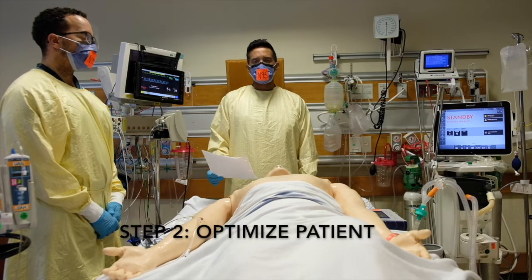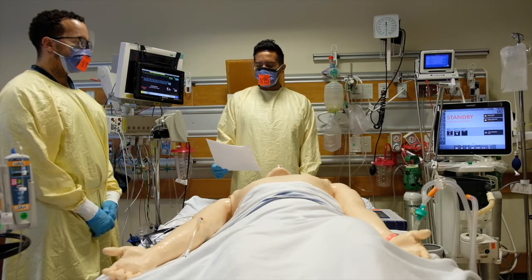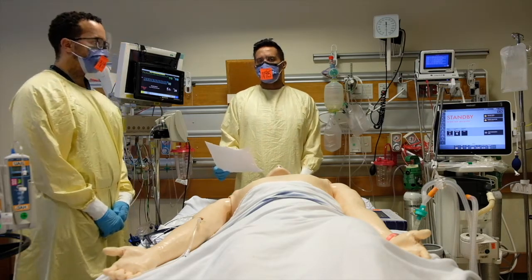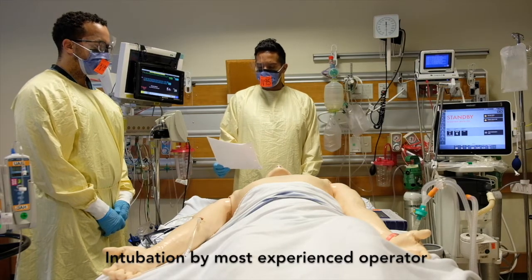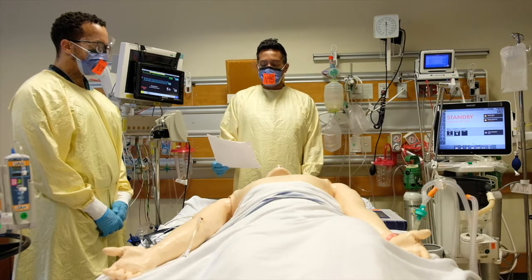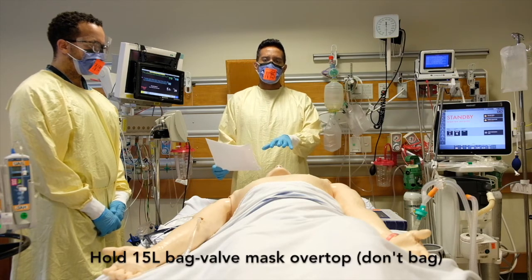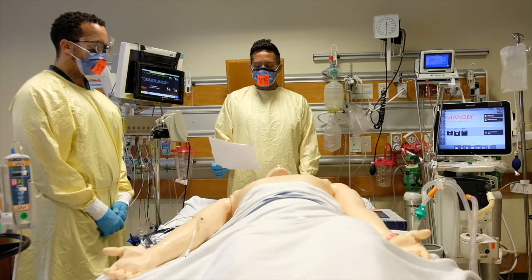So the second step is to ensure that the patient is optimized by the checklist. I've already completed the airway exam. There are no difficult airway characteristics, but if there were, we would consider getting anesthesia involved. And specifically for COVID-19 patients, we should always have the most skilled operator do the first attempt. The positioning is optimized. The patient is being pre-oxygenated currently on 15 liters via high-flow cannula, and we'll be putting the 15-liter bag valve mask on top with a seal with no bagging to ensure pre-oxygenation.